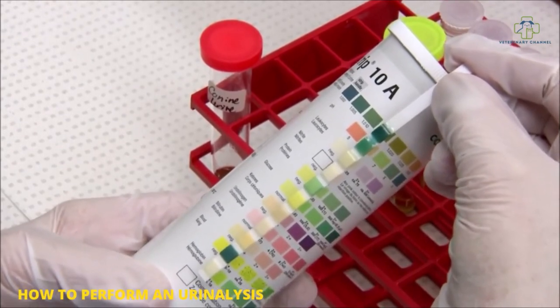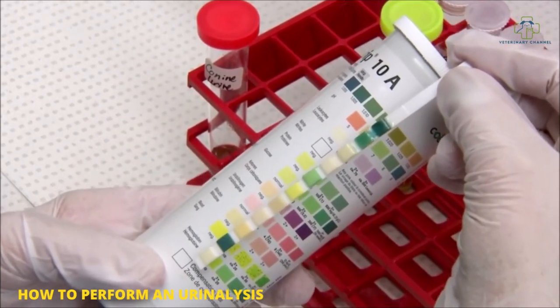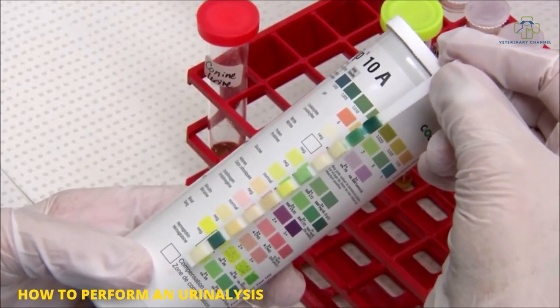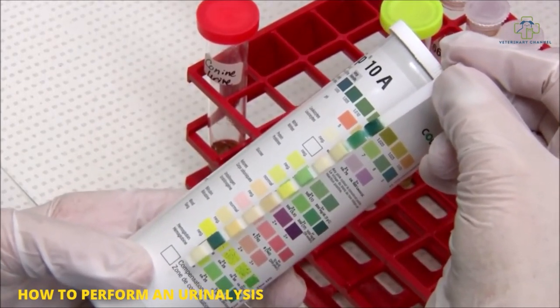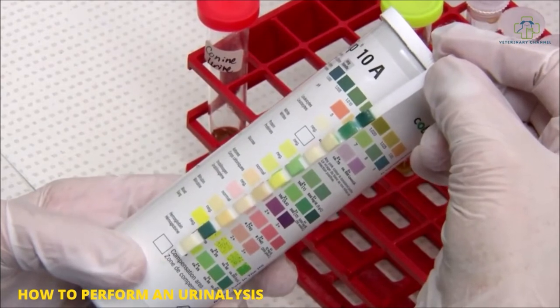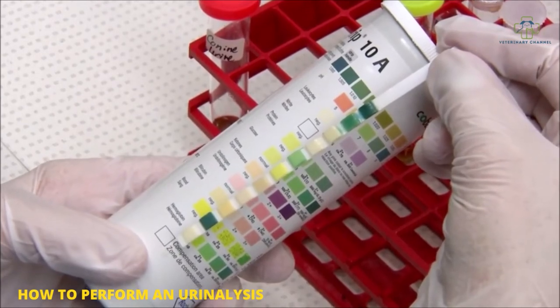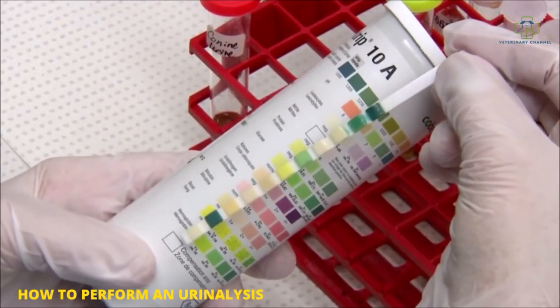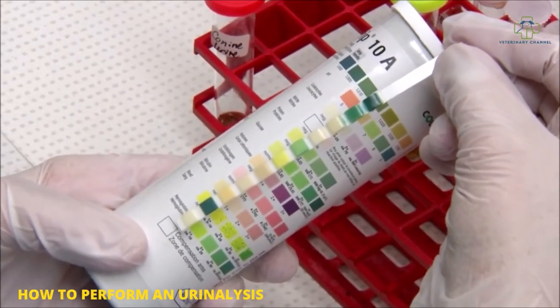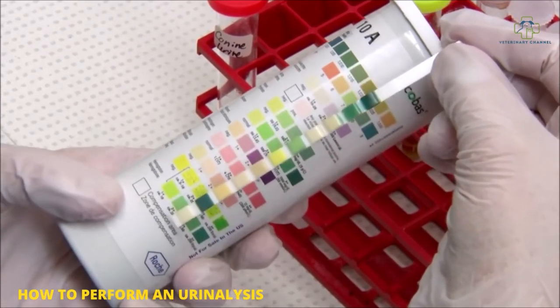We do the pH and report it as intervals of 0.5. Leukocytes is not considered significant in veterinary medicine, so we don't report that. Be aware that in cats they excrete an esterase, so this is always going to be positive in cats. Nitrites again is not considered important in veterinary medicine, so we don't report it. Protein is reported as negative, trace, and up to three plus. Glucose is the next square and is reported as negative and up to three plus as well.